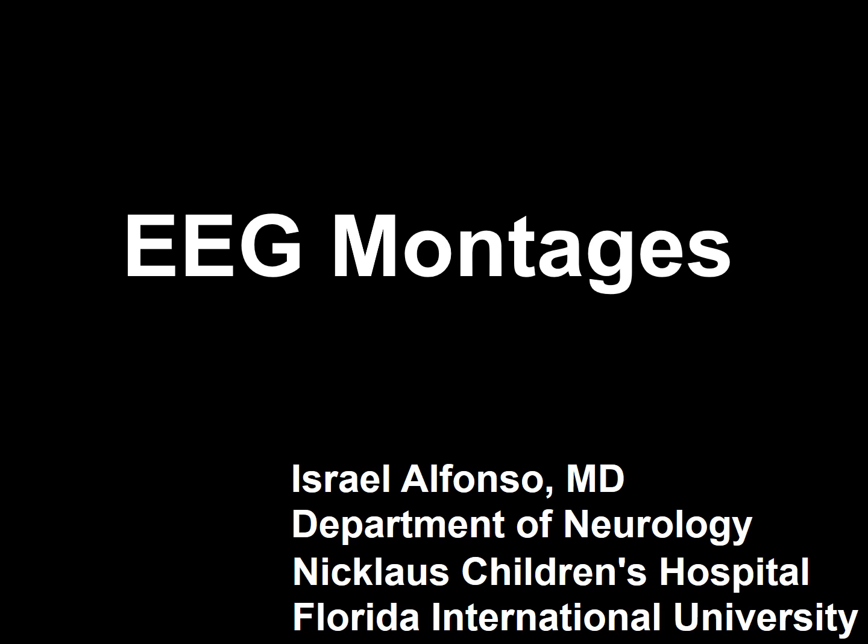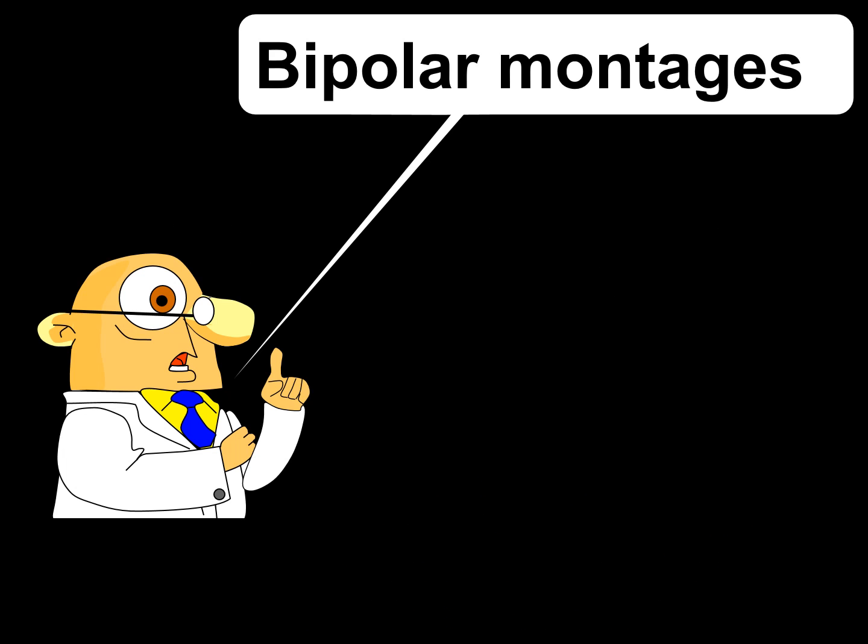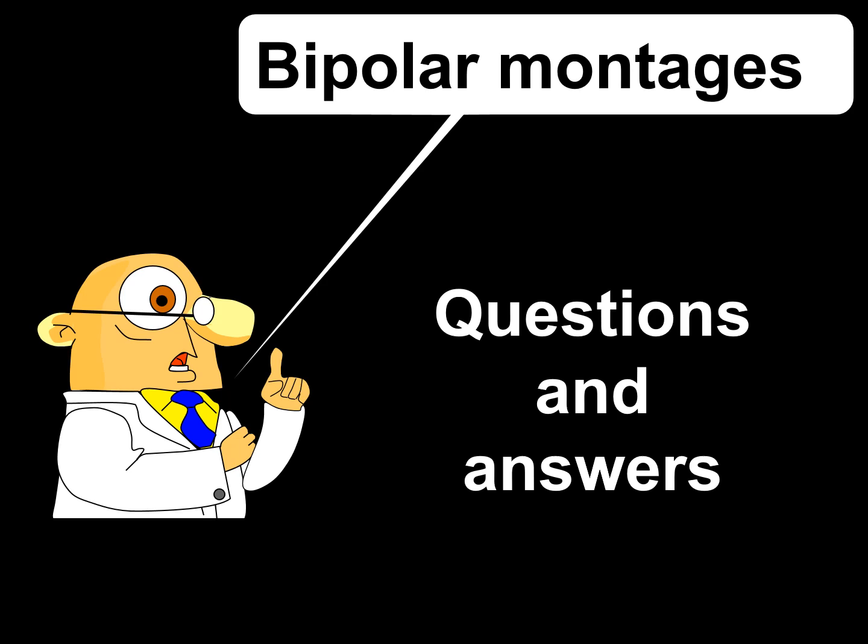This lecture is the second talk in a 5-part series about EEG montages. This section deals with bipolar montages. I will start this section using the question and answer format that I have used in the past.